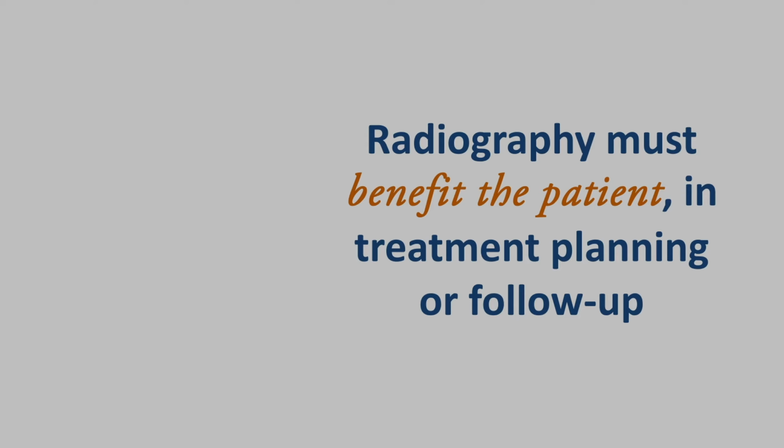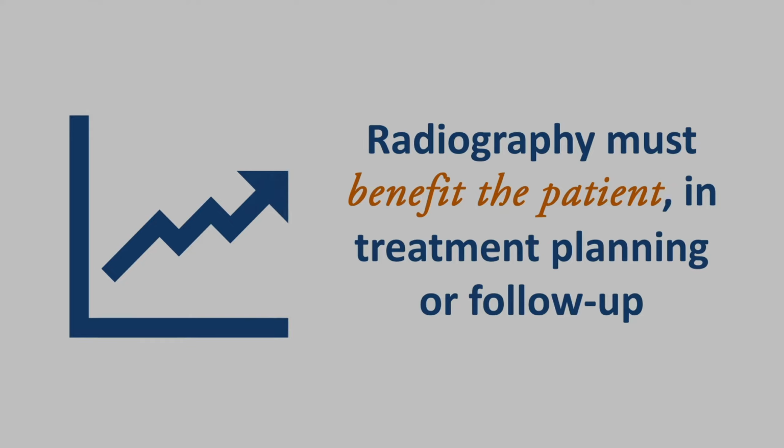For example, if we want to identify if the third molars are present, a panoramic radiograph is often sufficient. We should not order a CBCT scan to answer this clinical question. Remember that radiographic examination must benefit the patient either in treatment or in follow-up. We should never use radiography for the sole purpose of keeping a record or for making money. The same principle also applies to all clinical procedures. Do not do a clinical procedure just to make money.